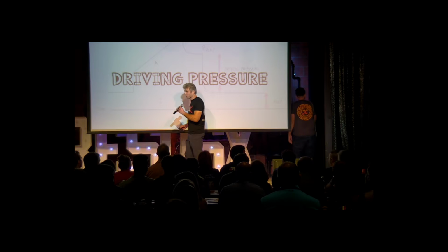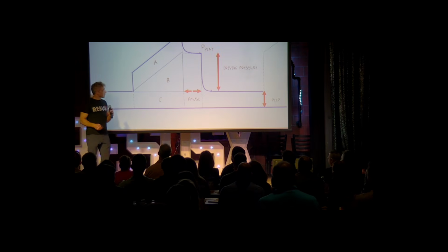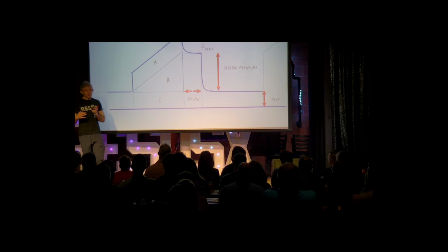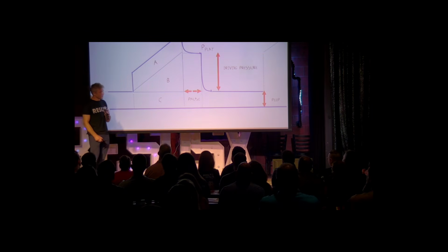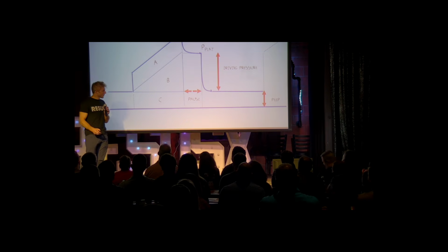All right, so we're going to talk about driving pressure. So driving pressure, I think, is somewhat overcomplicated. And the goal of this lecture here is to simplify it and teach you guys how to really use it on a day-to-day basis clinically.